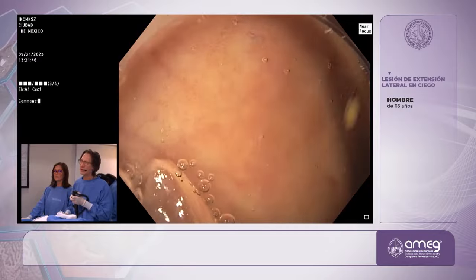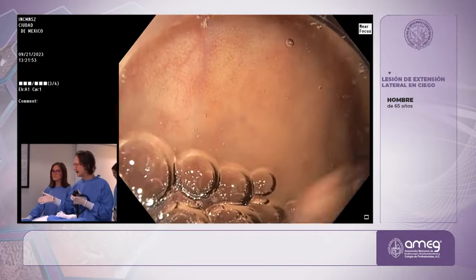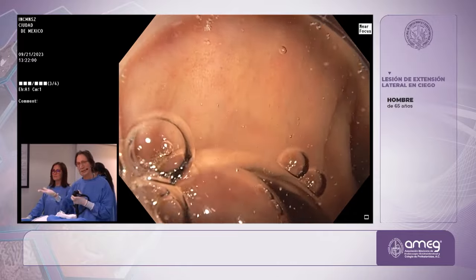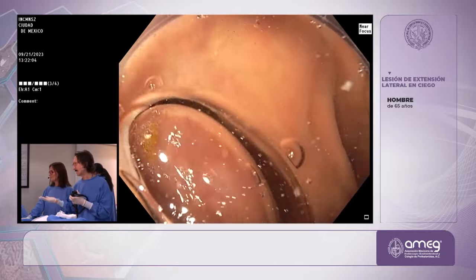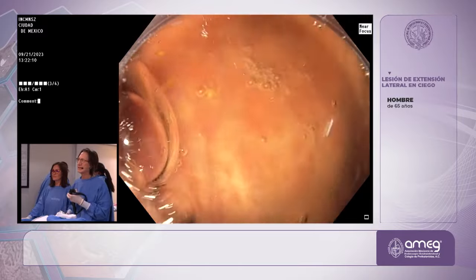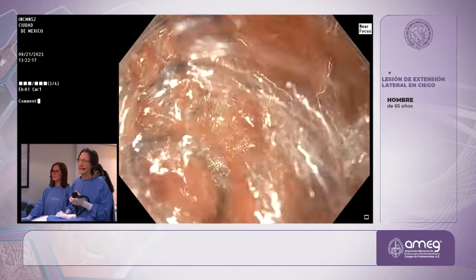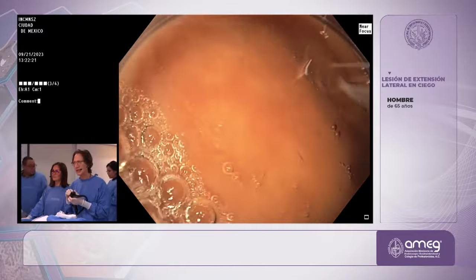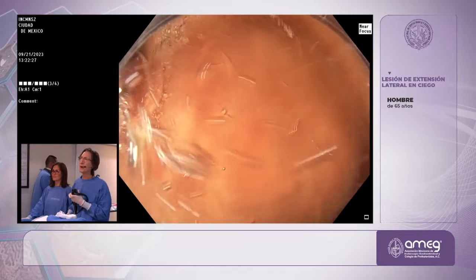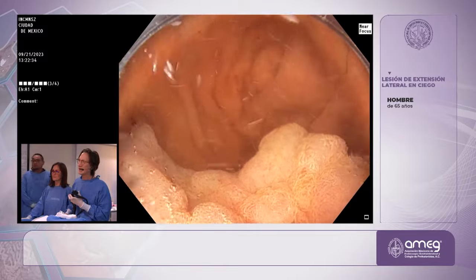I'm sucking out what happened. The other thing you need to tell the nurse or the assistant is to make sure that the water bottle is always filled, because I've been putting gas in, thinking it's water, but the water bottle was empty, so I was putting gas in. But I'll suck out the gas bubbles. This is gas bubbles coming from the water bottle, so the assistant needs to make sure. But that's my fault that I did not educate and inform the assistant that they need to keep an eye on the water bottle and make sure that the water bottle does not empty and fill with gas, because otherwise I'm putting air bubbles inside, and then it is a delay in my procedure. I have to suck out all the gas. All right, now here's the lesion.